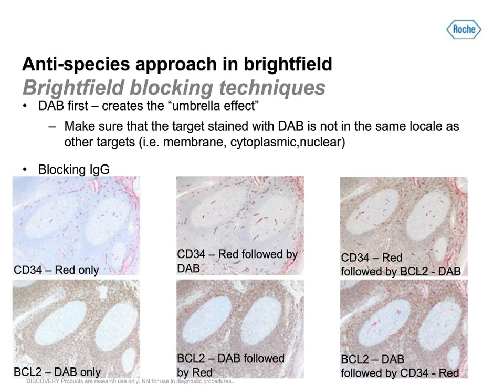All right, so as I mentioned before, in this example, we have the DAB, which is being detected first.